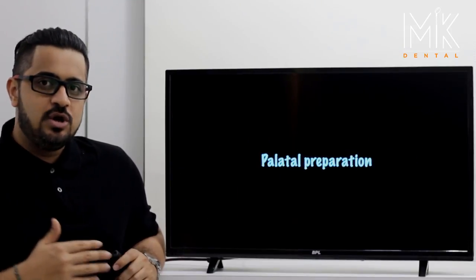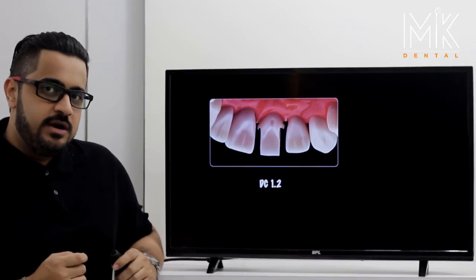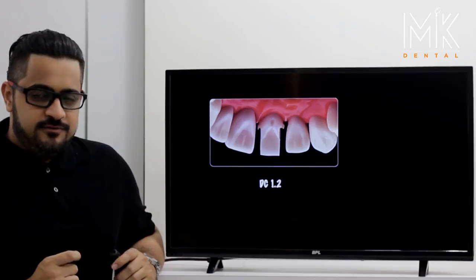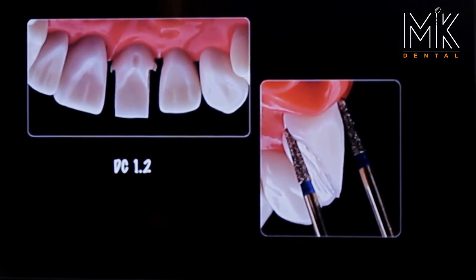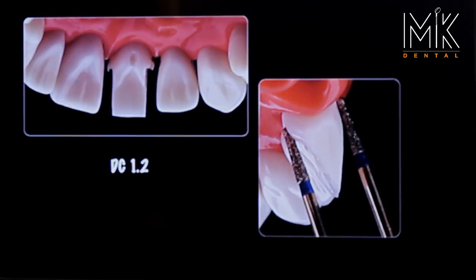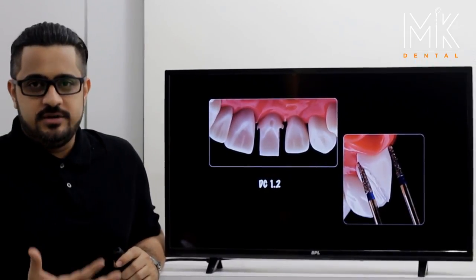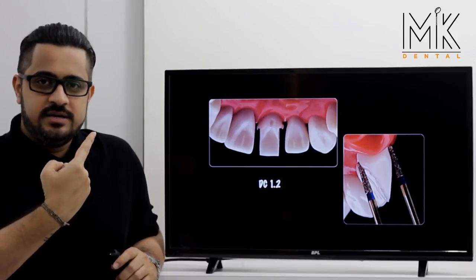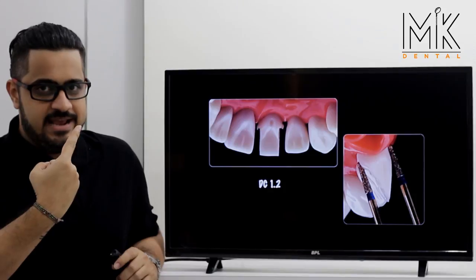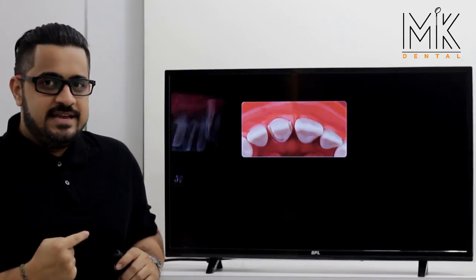Once the labial and proximal aspects are complete, you go ahead and do your lingual or palatal margin. This is classically done with the DC 1.2 burr. Most important when making this groove is to make sure the angle of this burr is correct. The palatal inclined surface should be parallel to plane one of the labial surface. Since this is indirect vision, you keep your burr on plane one of the labial surface, lock your wrist, lock your elbow, then take it into the palatal keeping the burr angle the same.